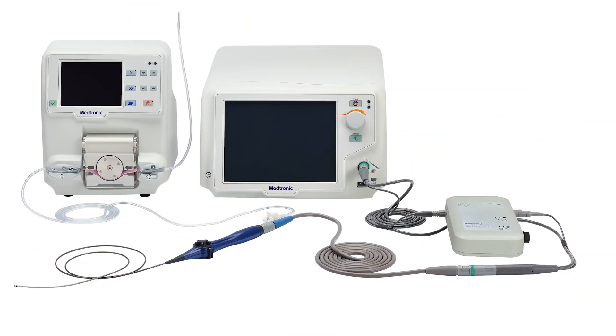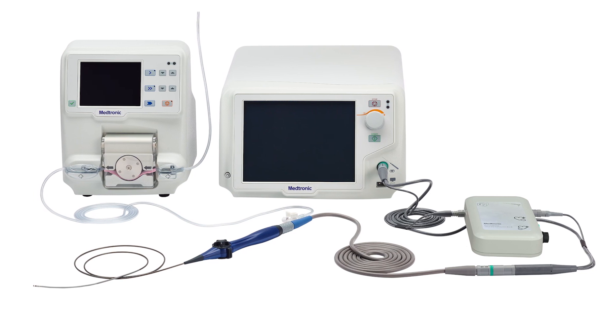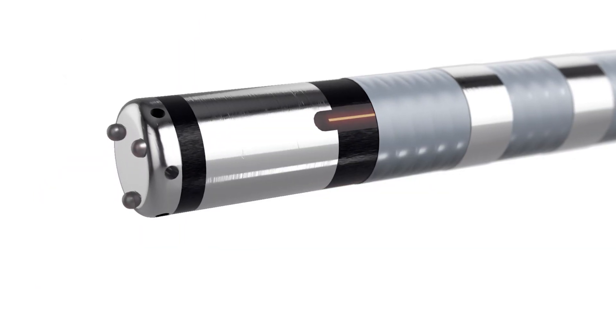I think the biggest benefit to patients in using any new technology has to be whether the procedure is going to be more efficient, and with Diamond Temp ablation we know that it is. Look at the clinical data — an eighty percent success rate that's as good as we've seen in any of our FDA-approved ablation technologies. If you can achieve that efficacy and safety, everybody wants that for their patients.